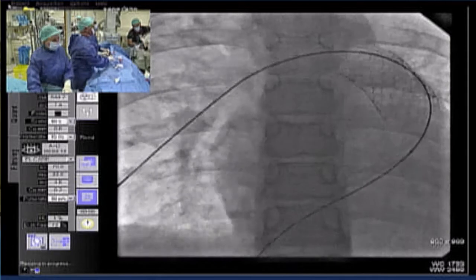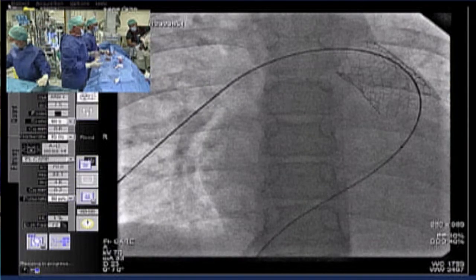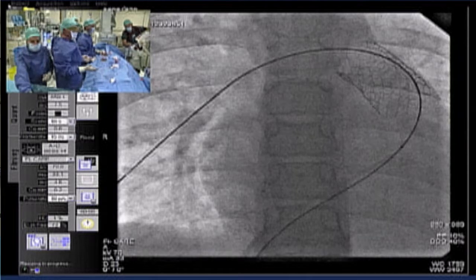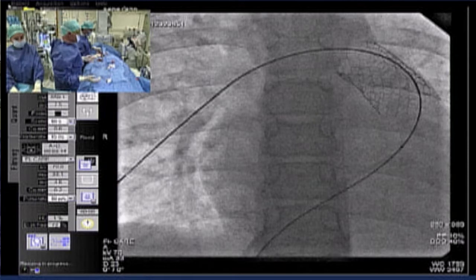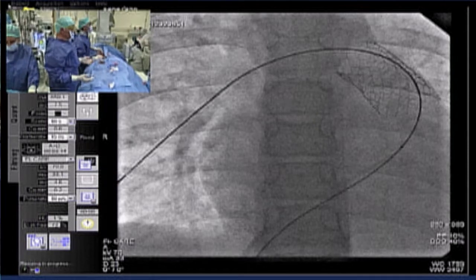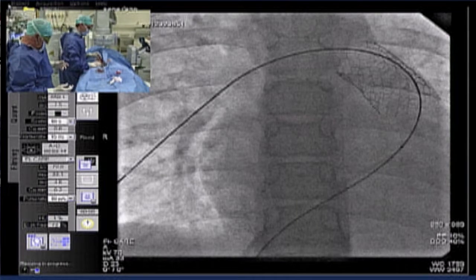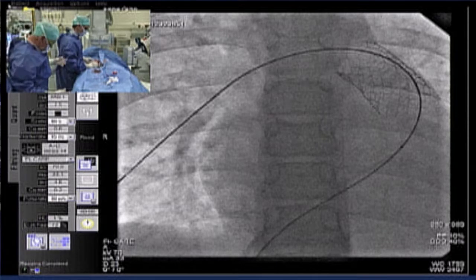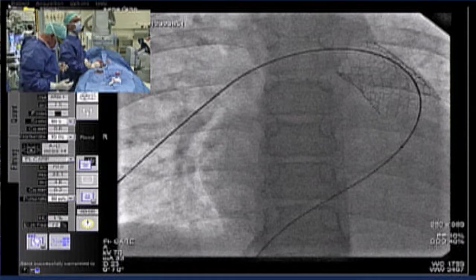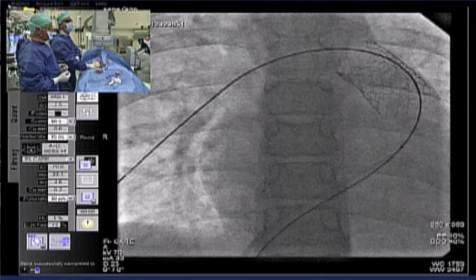What's the purpose of the angio? You said, just to define my landing place. I want to see, and especially if you use a Sapien, that's extremely important, where the stent touches the wall. Because if you put your stent in a position where there is a possibility of paravalvular leak, you will have a paravalvular leak. So I want to put the stent somewhere in the stent, but at least where there is a full apposition or adherence to the stent.